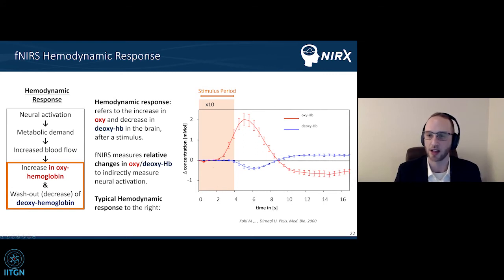And it really has to do with the study design. We are very, very good at localizing different brain regions with fNIRS, but of course, because we're measuring blood flow, you just have to wait for that blood to pump to different parts of the brain. You can't get those millisecond and hundreds of milliseconds types of responses in fNIRS like you can in EEG. But we see a lot of mixed design types of multimodal integration where you can do some fast change types of events in addition to these slower changes or these blocks to look at the fNIRS types of impact.